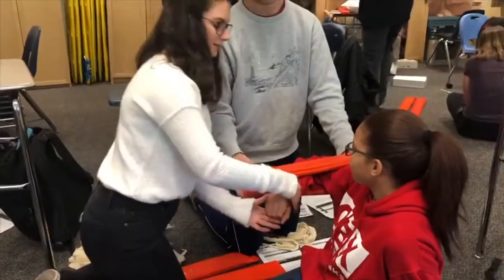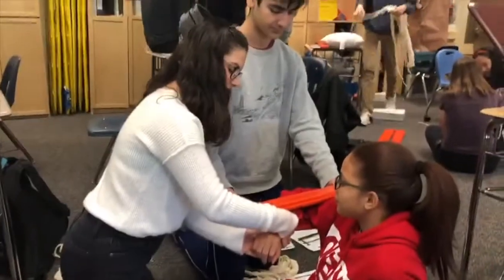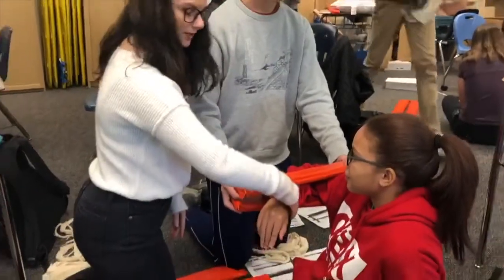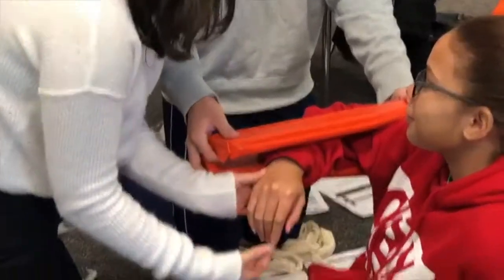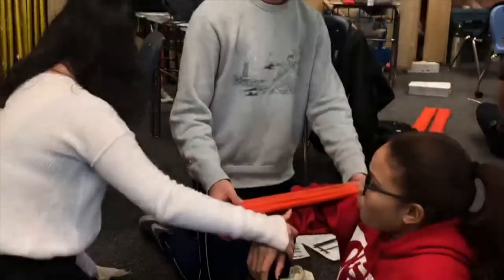Alrighty, so you're going to feel for PMS — pulse. Pulse is present. Can you move your fingers? That's motor. Turn away. What finger am I touching? Good. And that's sensory.